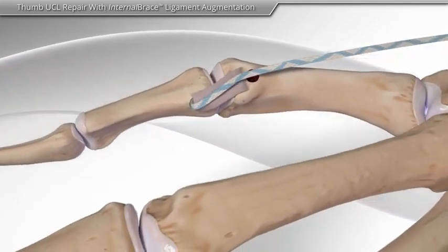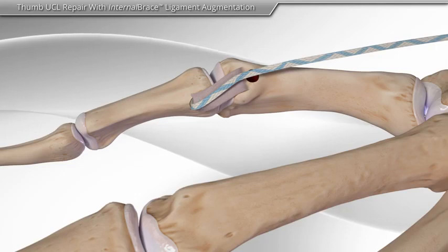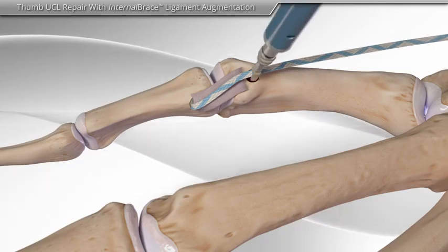Next, the suture tape is brought across the joint and inserted into the remaining socket to help support the repaired ligament.